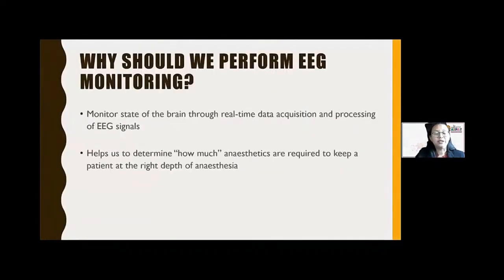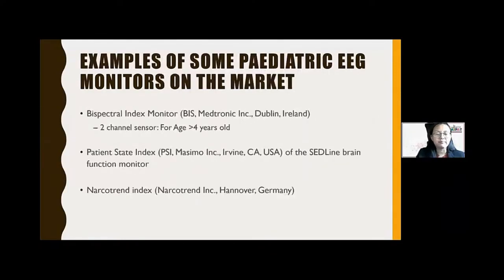So why should we perform EEG monitoring? EEG monitoring helps us to monitor the state of the brain through real-time data acquisition and processing of EEG signals. This helps us to determine how much anesthetics are required to keep a patient at the right depth of anesthesia.